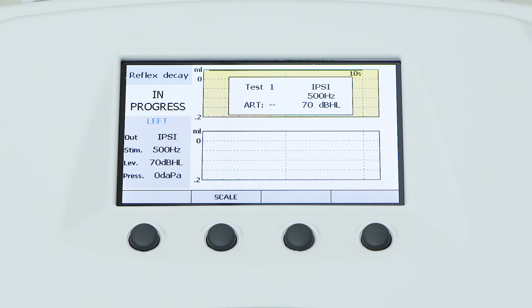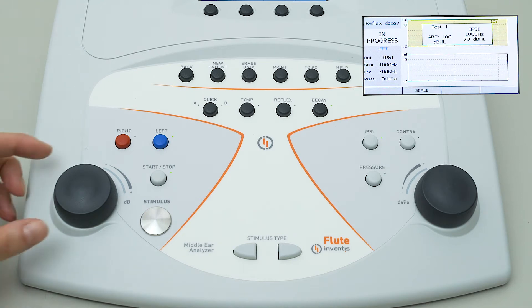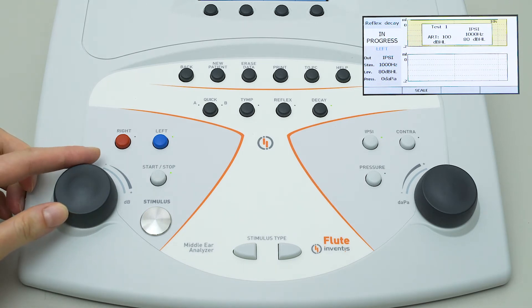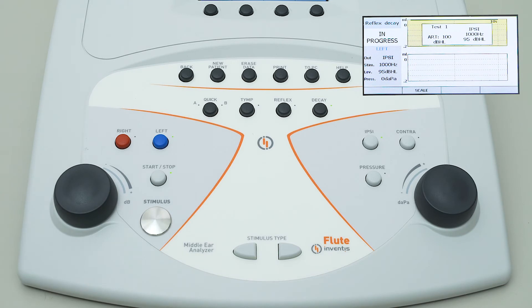The display will show a mask while the pressurization starts. Here the user can set the side, frequency, and intensity of the stimulus. When ready, simply touch the stimulus button to start the acquisition.